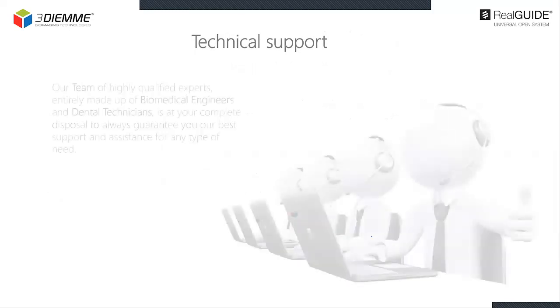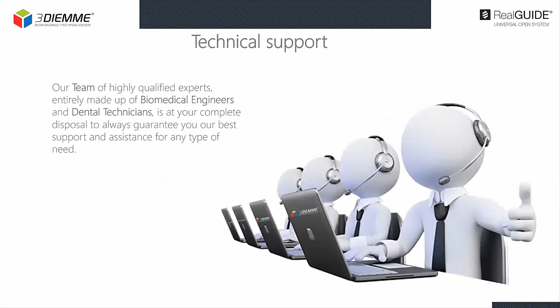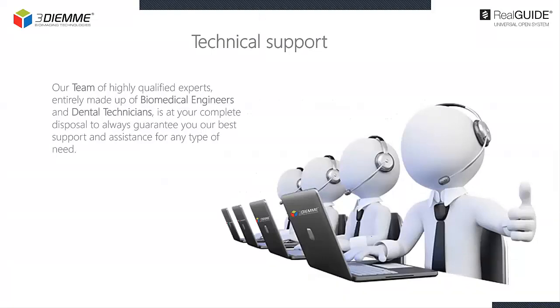The 3DM technical support is our pride. A team of highly qualified experts made up entirely of biomedical engineers and dental technicians is able to satisfy any type of need you may have, based on the type of your request.